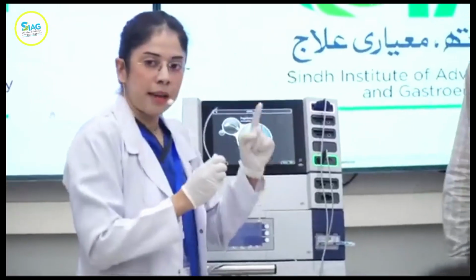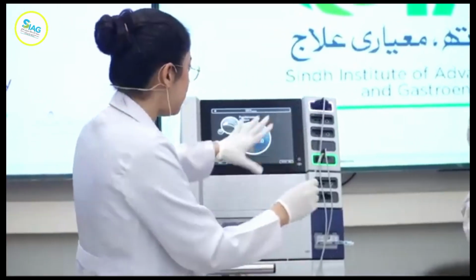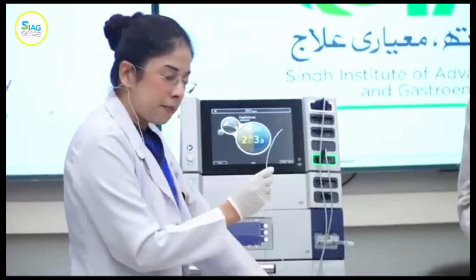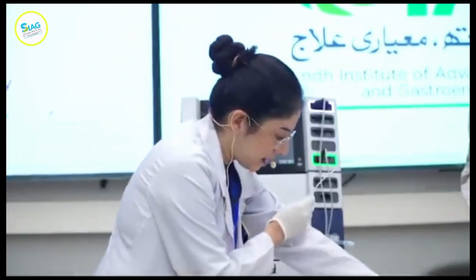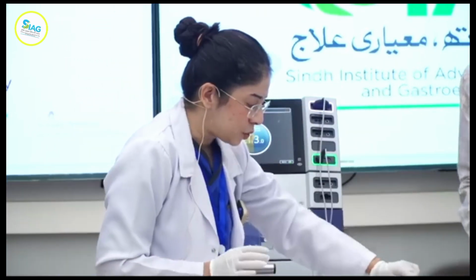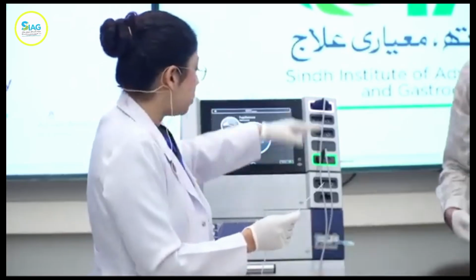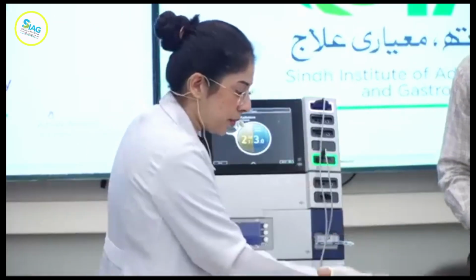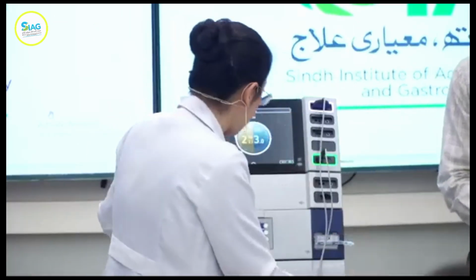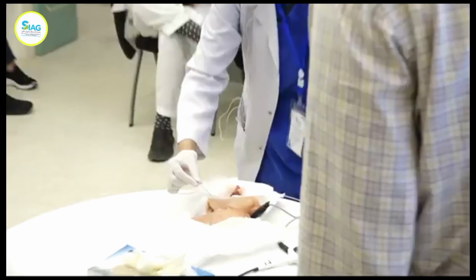So I'm going to take, as Dr. Khalid mentioned, this is a complete electrosurgical unit. And the circuit is complete. Why? Because this is your generator. I have the earthing pad connected to my piece of chicken. It's lying down on it, and I have my chicken. The circuit will be complete as soon as I come in contact with this. So I have my electrode wire entering the monopolar wire, and it's going to come in contact with the chicken. As I'm doing endocut, I'll be pressing the yellow pedal. Even the colors themselves tell you which pedal to press. And you'll hear some music.